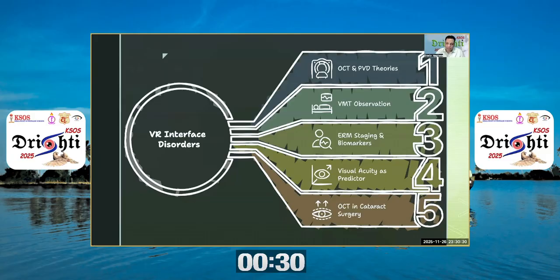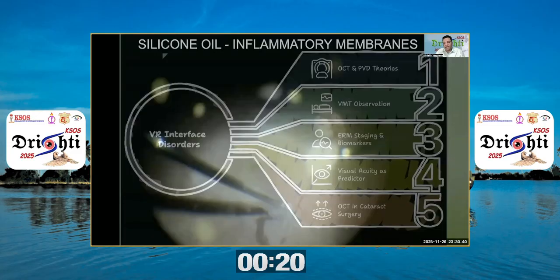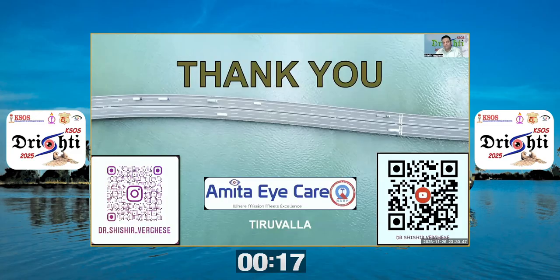the surgery. And most of these patients, they come for cataract surgery, and an OCT is a good tool to know the status of the vitreomacular interface before planning a cataract surgery. Thank you for your attention.